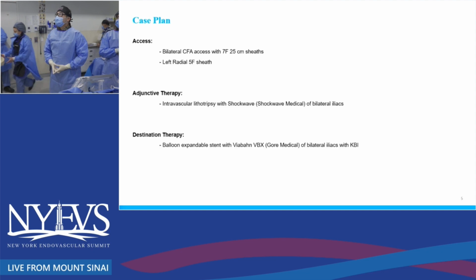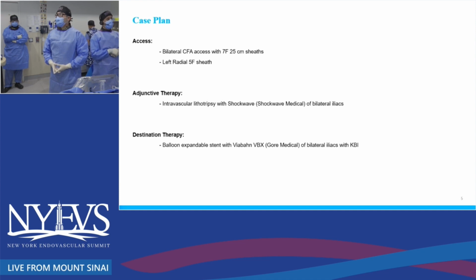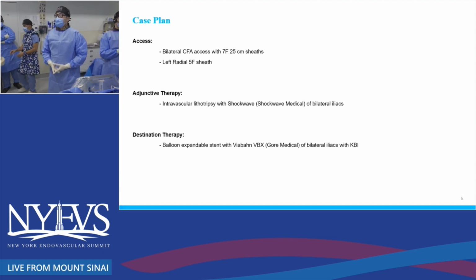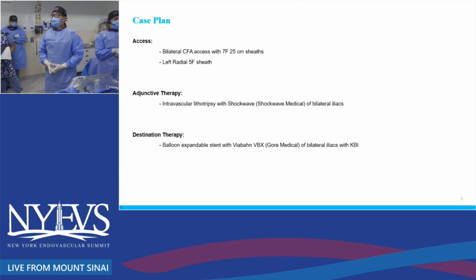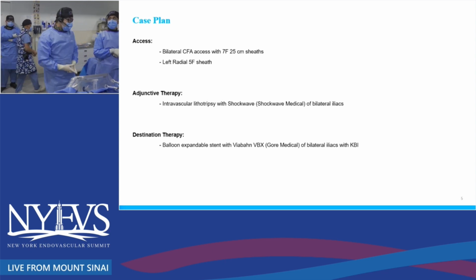Next slide, please. In terms of our case plan today, the access is bilateral CFA access with a 7 French 25 sheath and also left radial access with a pigtail for injection and hemodynamic monitoring. In terms of adjunctive therapies, we're going to use IVUS-guided imaging to size IVL for Shockwave, and our destination therapy is ultimately going to be a balloon expandable stent, the Viabahn VBX, of the bilateral iliacs with the kissing balloon inflation.